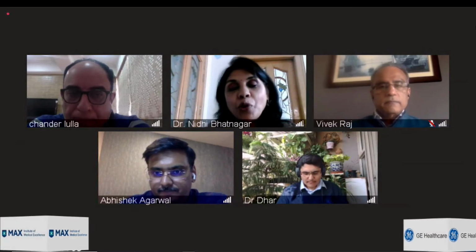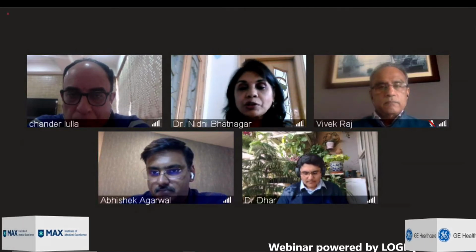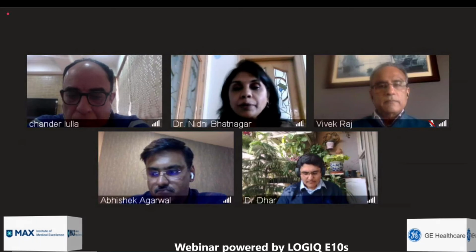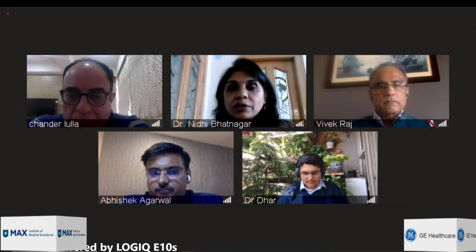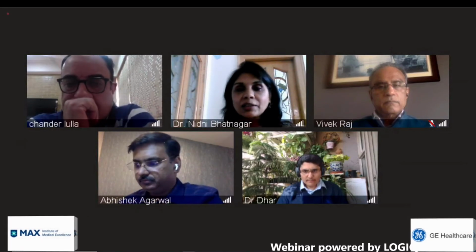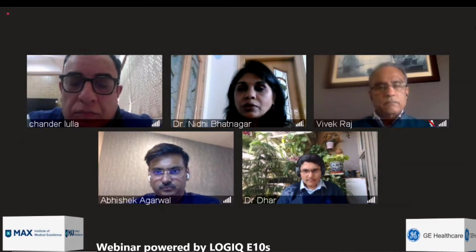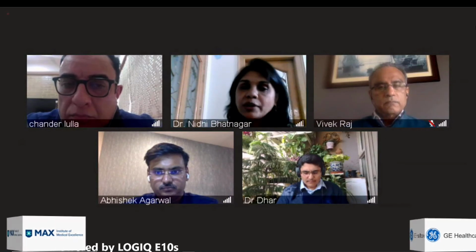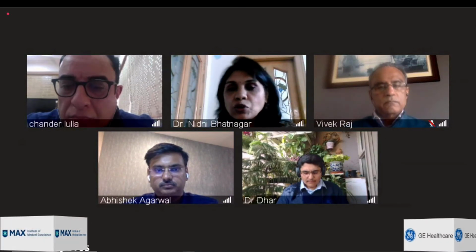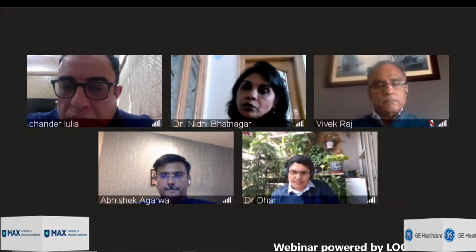Okay, so I'm going to go on from our speakers, our faculty, and pick up their points. Dr. Vivek Raj was very sensitive in picking up the point that when we use transient elastography, a limiting factor is that there is a technician doing it. It has its pluses and minuses, but since there is a technician, there is hardly any transaction of information. Whereas when we are doing a shear wave, we have a radiologist doing it who can really give quality added information. So that's Dr. Vivek Raj's opinion.